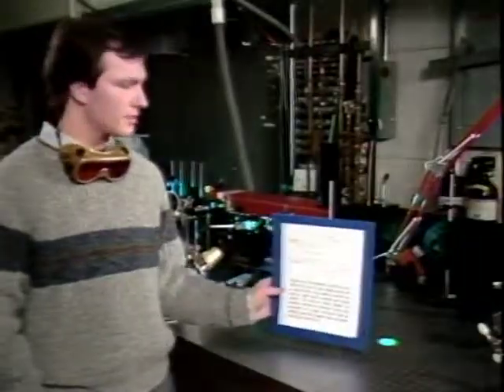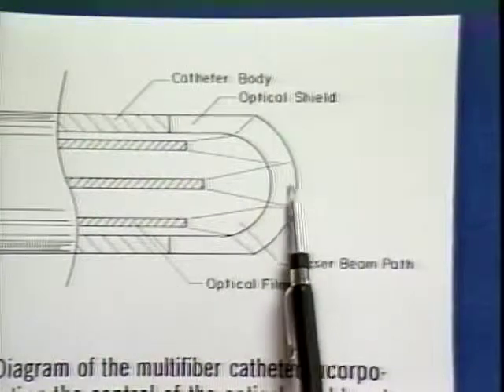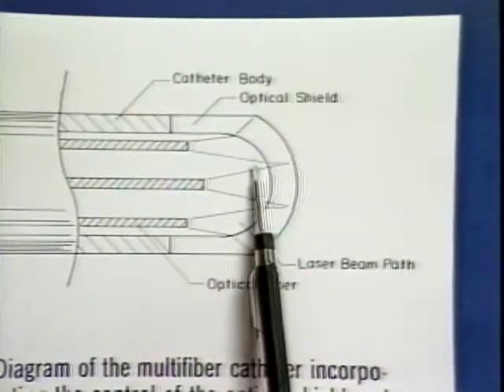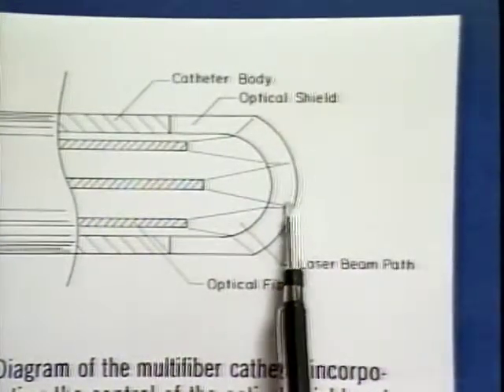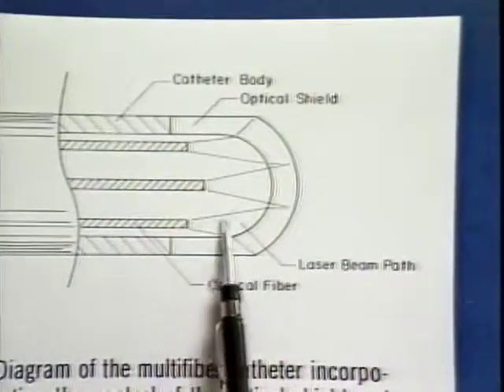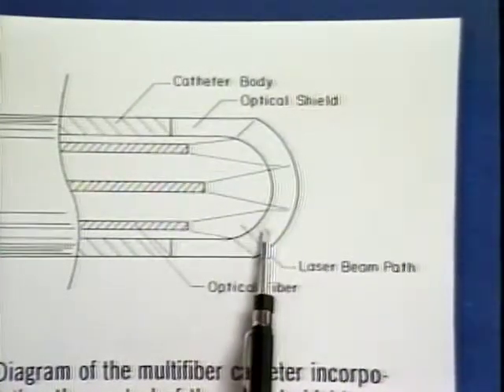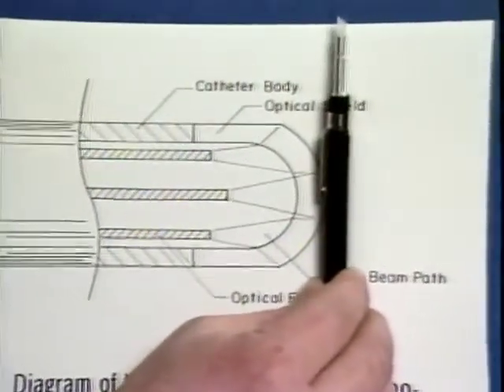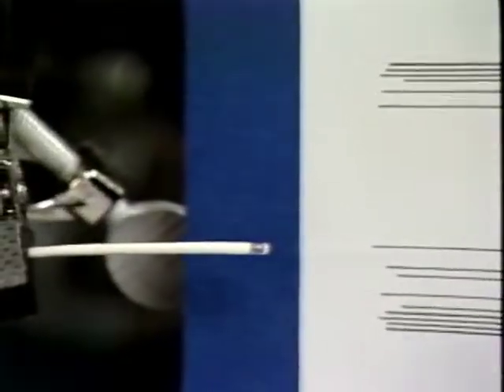This diagram illustrates. The optical fibers are placed a predetermined distance from the output surface of the shield. By knowing this distance and the angle at which the light diverges from the fiber, we can determine the spot size on the output surface of the shield. Each fiber is aimed at a different location on the shield so that there is full shield overlap. The shield is then placed in contact with tissue. This is one such laser catheter.